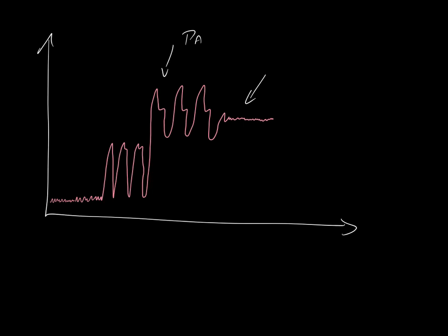Pull back? What do you mean pull back? Or have them cough. No, not for wedging. It's the first thing we need to do. Deflate that damn balloon, right? Make sure the balloon's deflated. And remember, we need to have the special 1.5 milliliter syringe. Take that with us. So make sure it's deflated. That's the first thing. And then there are other things like pulling it back, if you have to.